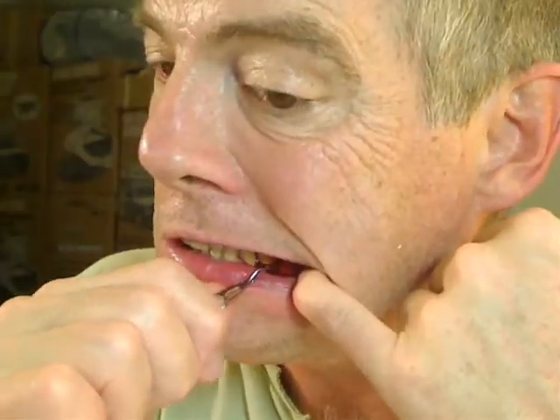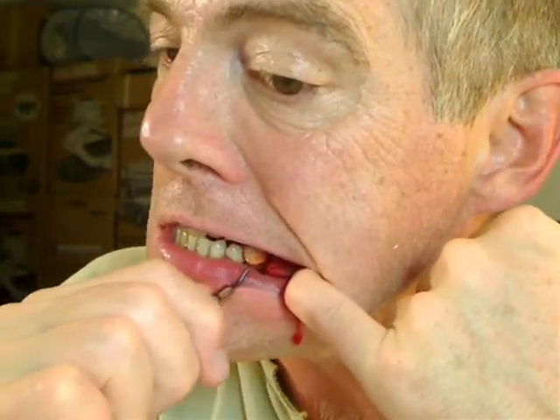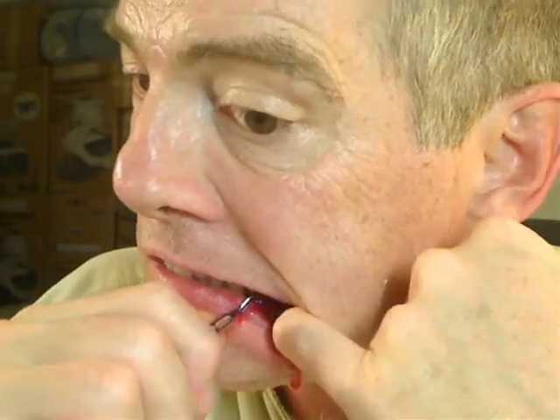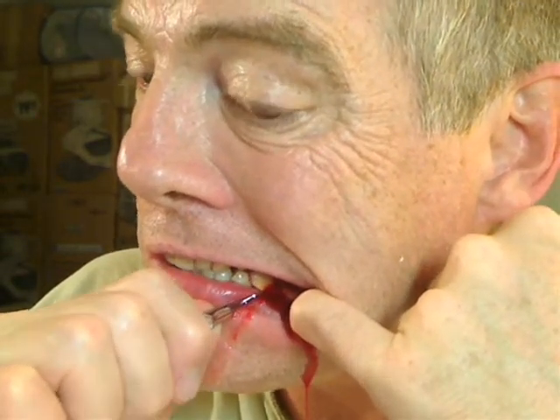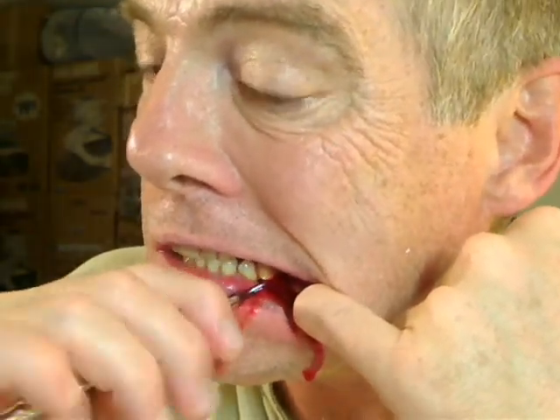What I want to do now is smooth the tooth in that area. I could use a sickle — at this point I want to start to mellow out here. It's sort of interesting that it's releasing now. You could have had a chance to regroup and now it's just pouring out. More large blobs — multiple large blobs. This is very positive. One way or another this thing is going to go.